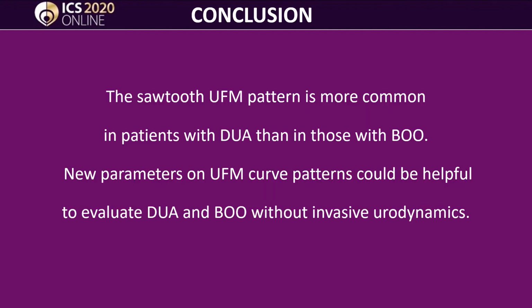So we conclude that the sawtooth pattern is more common in patients with detrusor underactivity than in those with obstruction. New parameters on the uroflowmetry curve pattern could be helpful to evaluate detrusor underactivity and obstruction without invasive urodynamics.